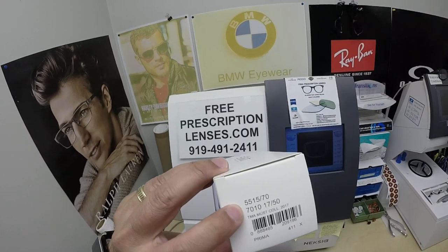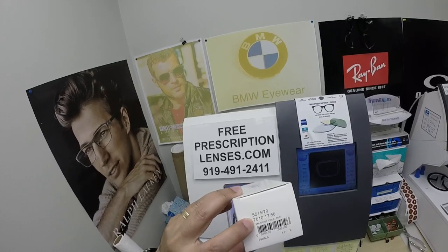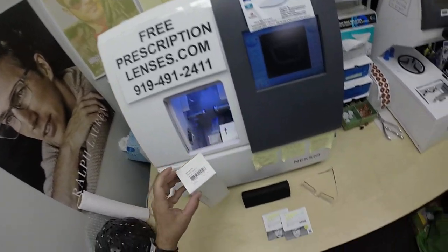When I show you Mr. Green's Silhouette 5515 — it's a drill mount frame — that is color 7010, 17 bridge, 150 temple length.